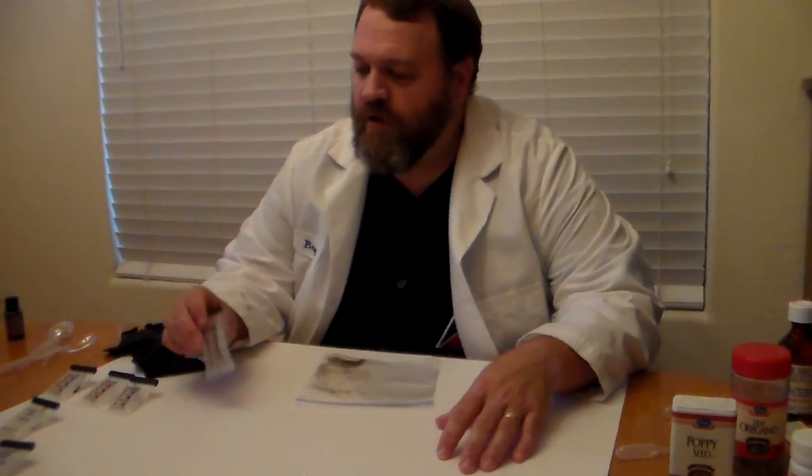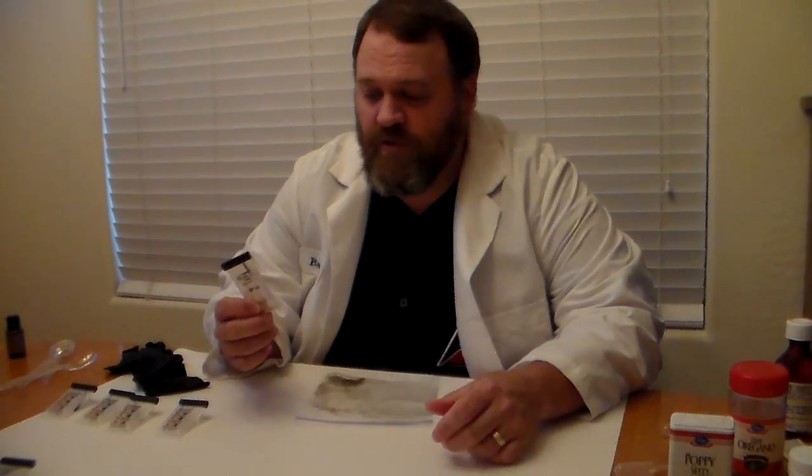Alright folks, now that we've got all our supplies ready to go, I want to show you how to actually do these tests. The two tests we're going to be using for this particular exercise are the Marquis Reagent Test, which is primarily used to help identify amphetamine, methamphetamine, and opioids like heroin, morphine, and codeine, and then the other one is the Duquenois-Levine Reagent, which is used to identify marijuana.